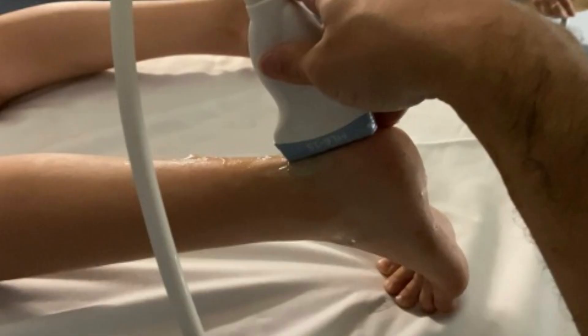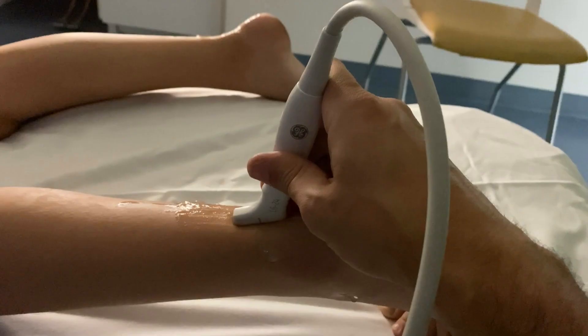For this exam, I like to use the 15 MHz linear transducer or the hockey stick, which is 18 to 24 MHz. The amount of resolution you can get with the hockey stick is amazing.